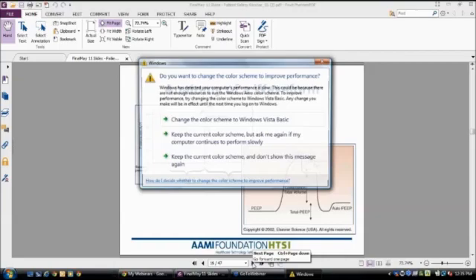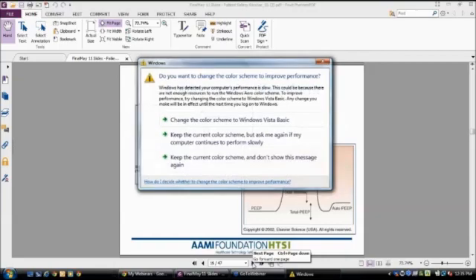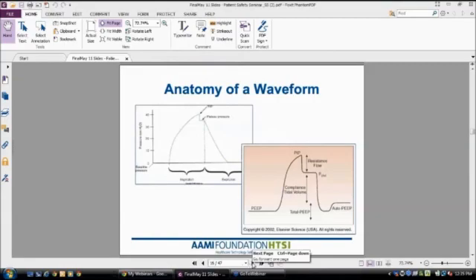Resistance. So the bigger that gap, the more resistance our patient has, the more resistance the breath had to overcome to get that breath into the lungs. And the difference between our plateau pressure and that baseline, or the PEEP, is determined by the amount of tidal volume set and your patient's compliance.